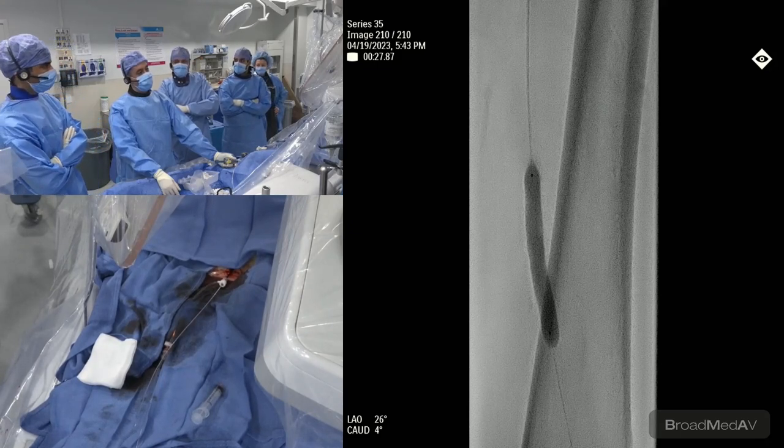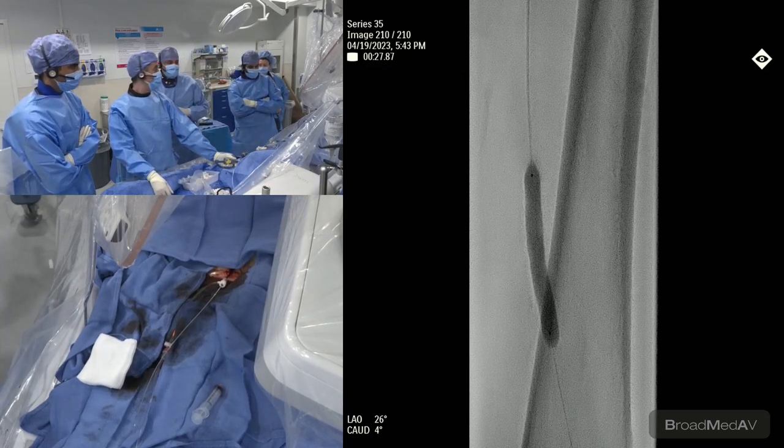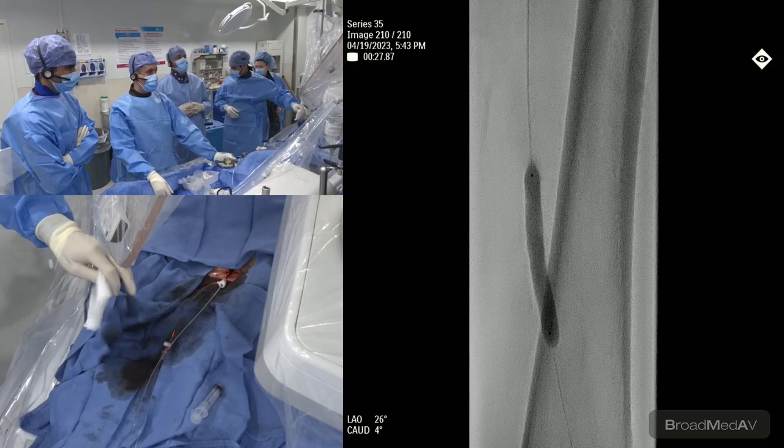So now I'm going to get a 6060 Supera, right? Do you want to go with a 60 or 40? 60, right? So 6060 Supera. Yeah, we'll take a picture.